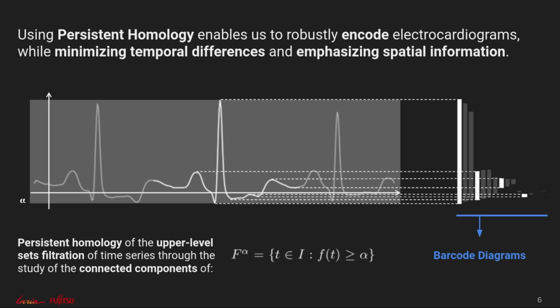Obviously, for the sake of our problematic, these diagrams can be created on consecutive heartbeats, as shown here with 3, because sometimes abnormality or arrhythmia is actually defined by the relationships of one heartbeat with either the one that preceded or the one that followed. So it is very important to take all that information into its context.